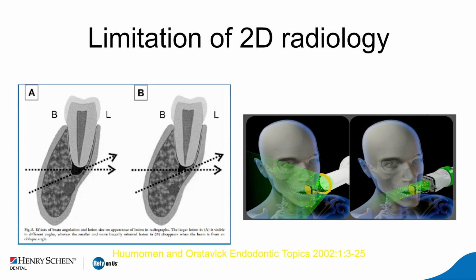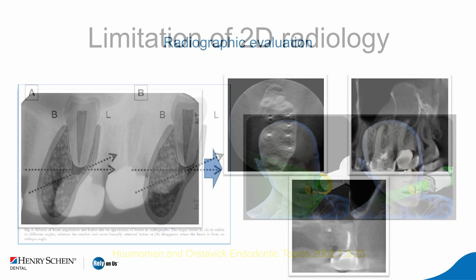If you think of the radiologic beam, you see on the left aspect of the screen that if the beam is at an angle while it's crossing the mandible, for example, the apical third of the root is going to obliterate the radiolucency. So you won't see any problem, but there is. So the sensitivity and specificity of a CBCT is a lot more than on PAs.